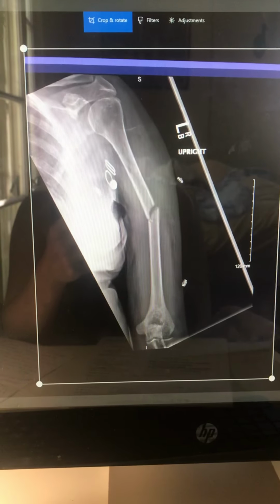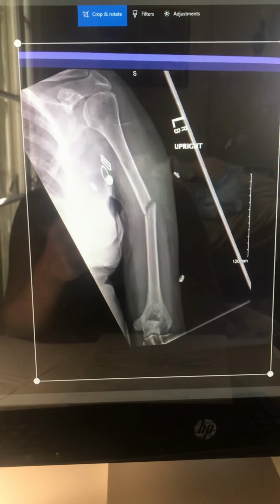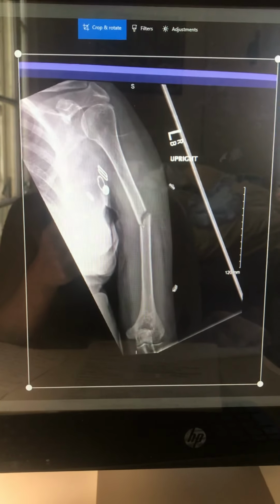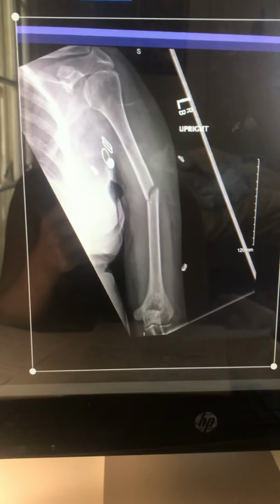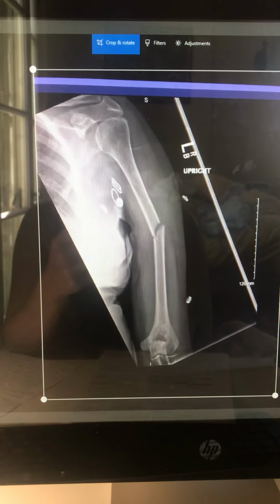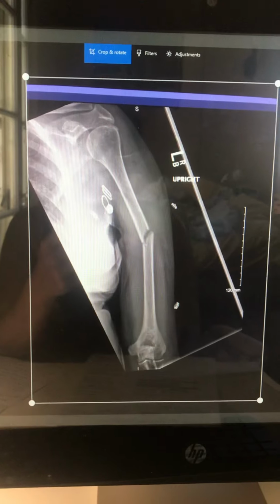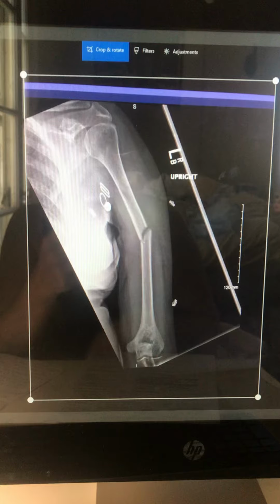Projections: there was the AP and the PA lateral. The patient was a 55-year-old female, ambulatory. The physician's findings were a fracture at the mid portion of the humerus. A 16x16 digital detector with the upright bucky, which has a built-in grid. Technique was AEC 75 at 2 mAs for both projections. The SID is 40 inches.